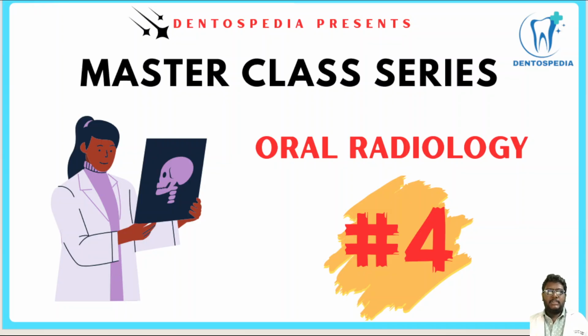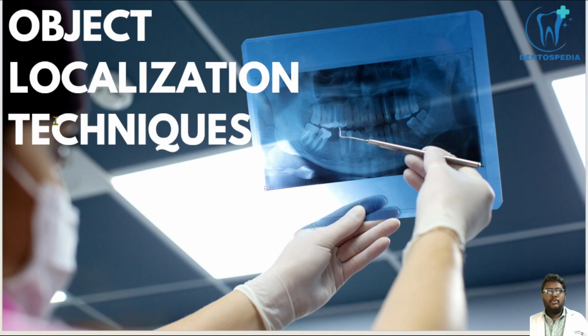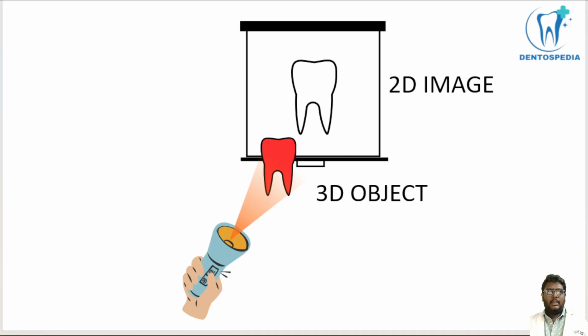Today we're dealing with the fourth session of oral radiology, and today's topic is object localization techniques. In oral radiology, we commonly expose the teeth with X-rays, right? During this process, we are projecting the X-rays onto a three-dimensional object. The teeth are nothing but a three-dimensional object, right?